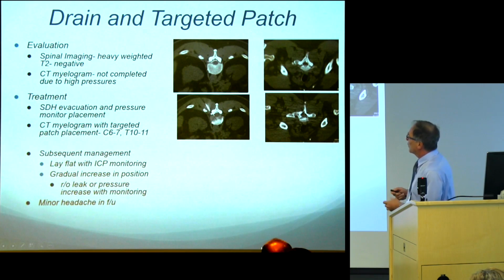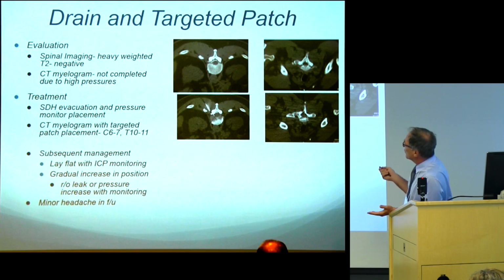The CSF leaks are really amazing because they're hard to find. They're intermittent, episodic drainage, and a simple myelogram might miss it because you might not see the contrast egress, because it's either out before you do the image or it doesn't leak during the image. So we have a system called dynamic CT, in which you have the patient right on the CT table, you inject fluid, increase the pressure, and elicit a leak.